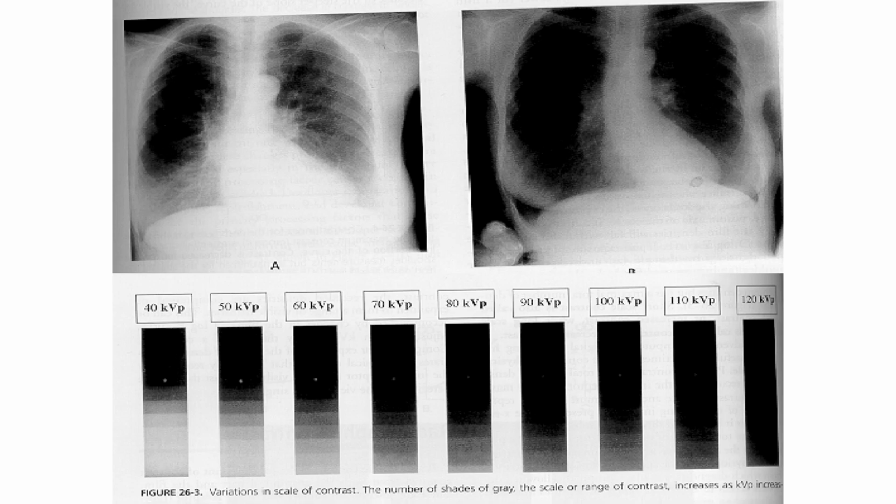Kasi una-una, very dark yung lung field. Hindi natin ma-determine if there are other pathologies sa upper lungs. Di ba? Doon kitang-kita yung heart, pero hindi natin ma-determine if there are other pathologies sa lung field. Okay?